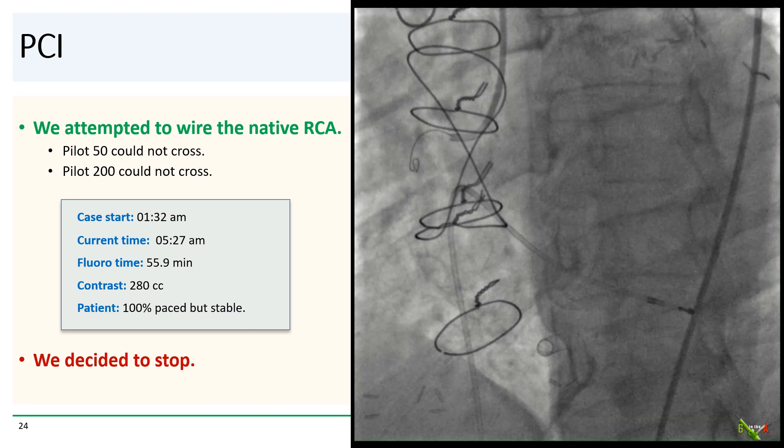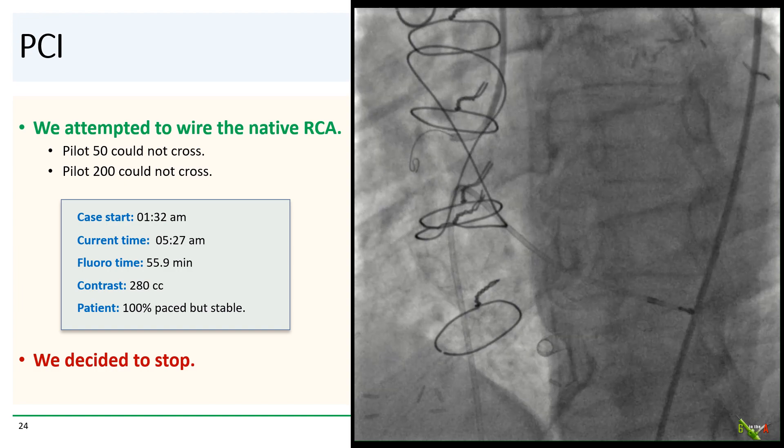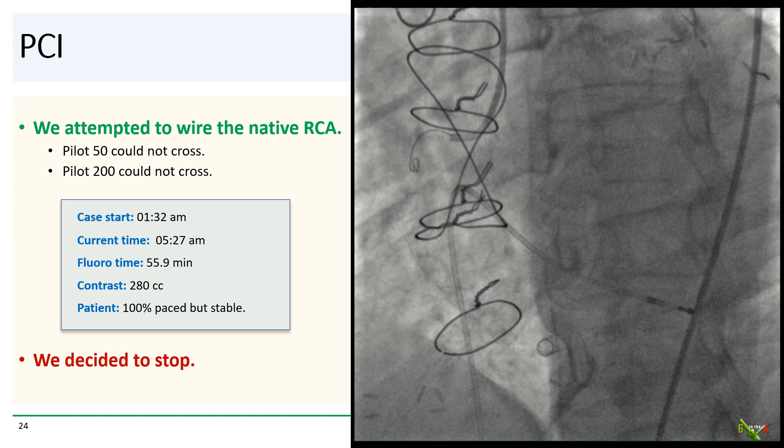We then attempted to wire the native RCA. We tried a Pilot 50 and then a Pilot 200, but neither wire could make it across the occlusion. At this point we were four hours into the case — started at 1:32 AM and it was now 5:27 AM. We had used 280 cc of contrast and nearly 56 minutes of fluoroscopy time. The patient was 100% paced but hemodynamically stable with no chest pain. We were tired. We decided to stop.